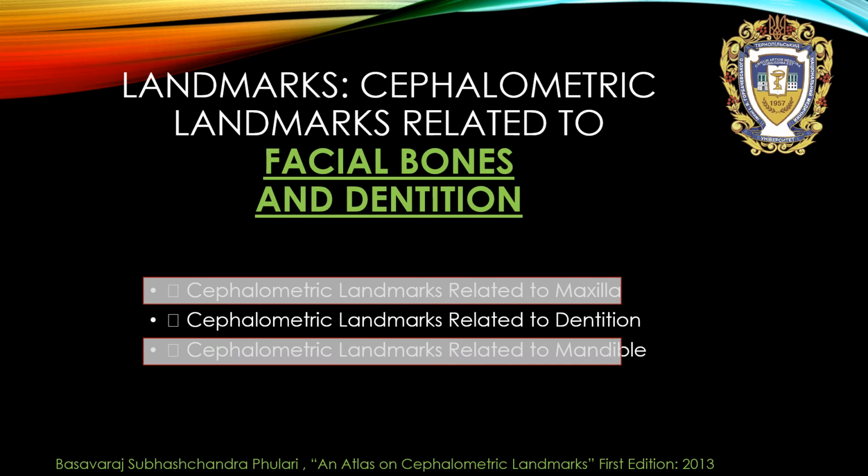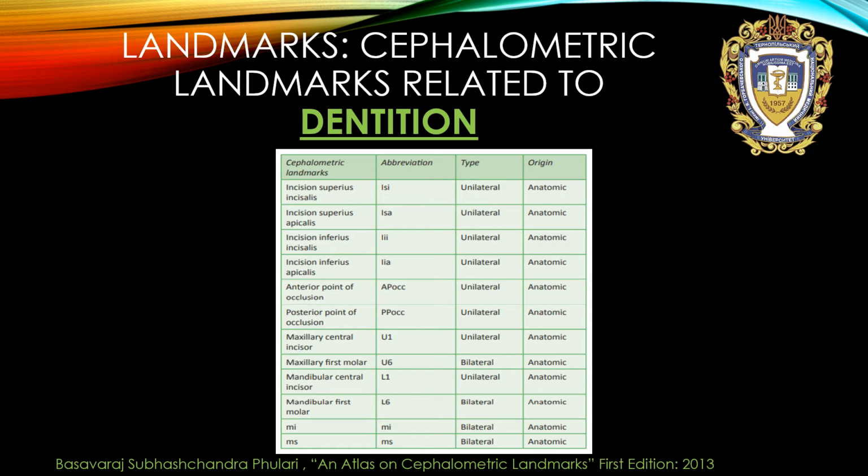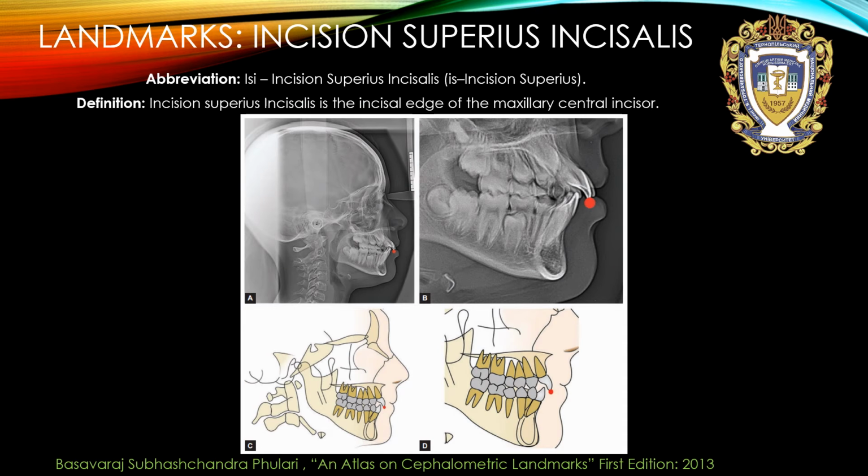Cephalometric landmarks related to dentition. There are so many points too, and the most important are next.